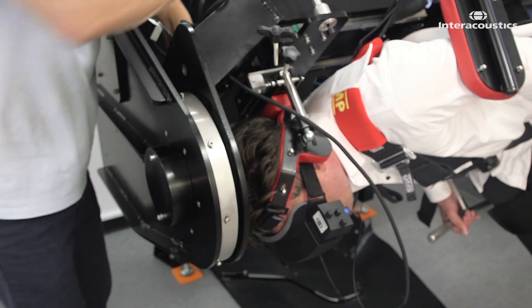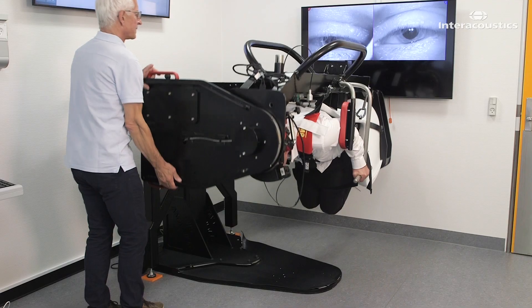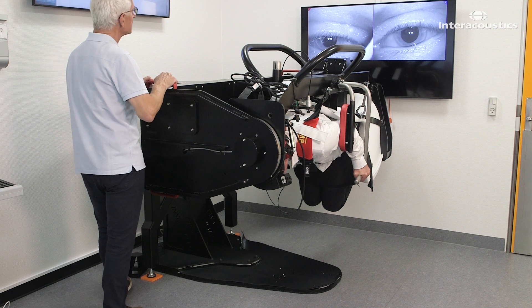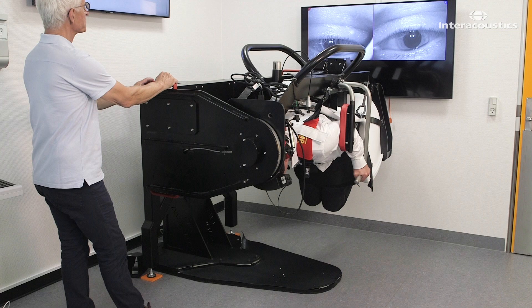In the final position, the patient's nose is pointing straight down. Apply 12 rapid decelerations and then keep the patient in this position for 30 seconds before returning them to the upright position.